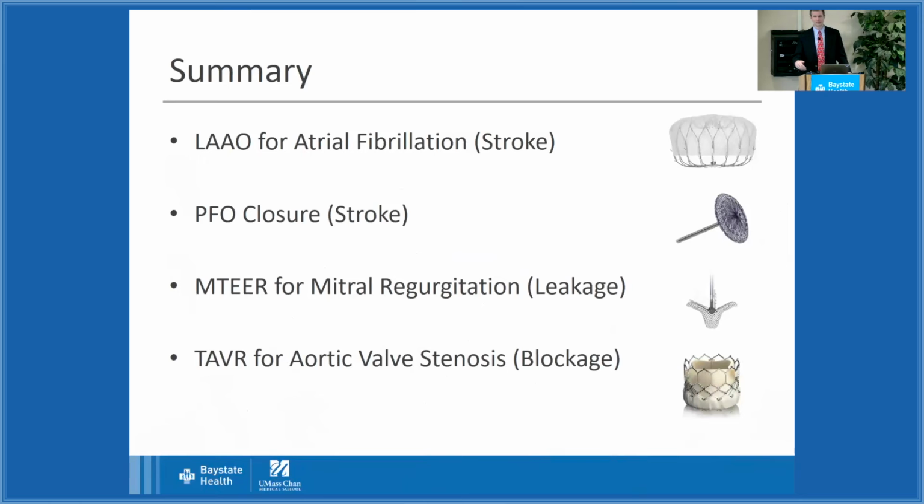Okay. They tell you you're supposed to say what you're going to say, then say it, and then say what you said, right? So this is what we talked about. We talked about left atrial appendage occlusion for atrial fibrillation to prevent stroke, right? Those are those devices that plug the hole in the heart if you have AFib so that you don't need to take a blood thinner ever again.